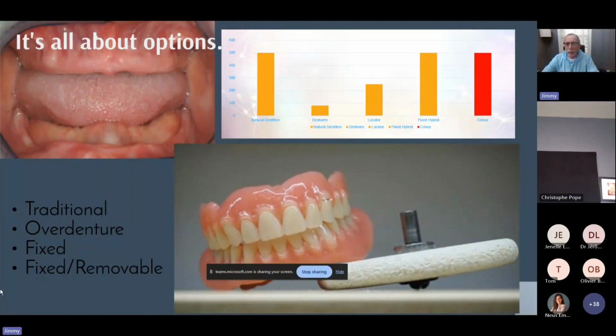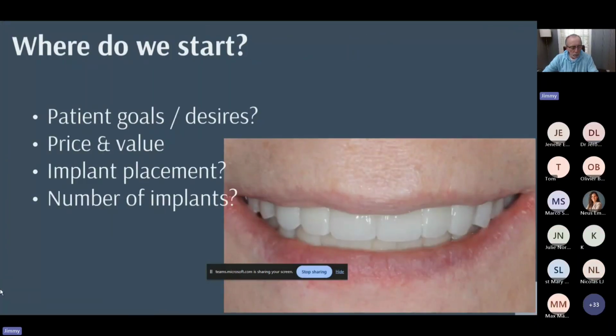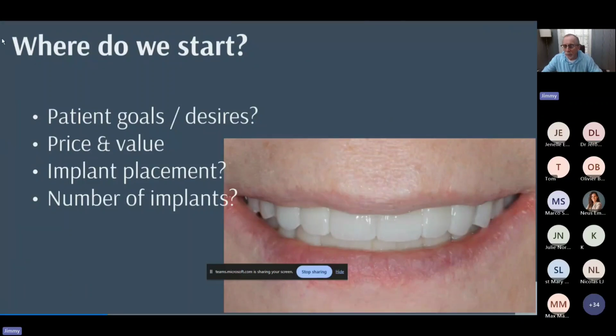And I think we look at the circumstance and we try to decide, what is the patient's goals, right? What is it that they have a need for? What is it that they have that they don't like? Quite often I will hear an 80-year-old grandmother say, I don't mind my denture that much. I just wish it stayed in better, right? That's an overdenture conversation. That's a DESSLoc conversation.